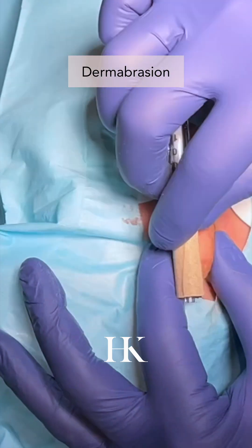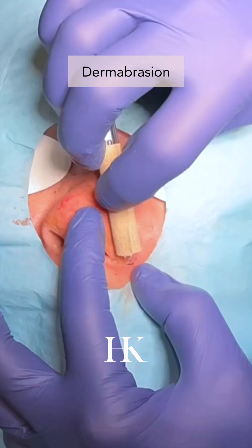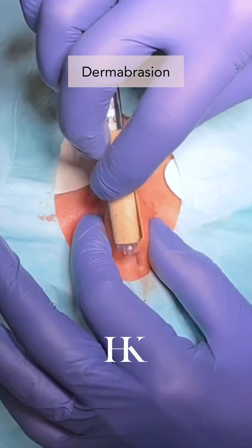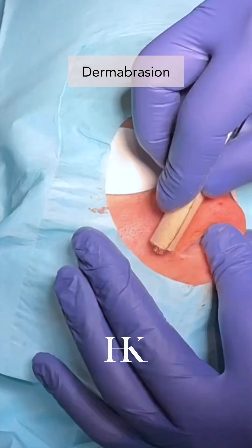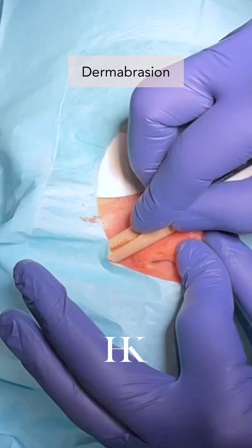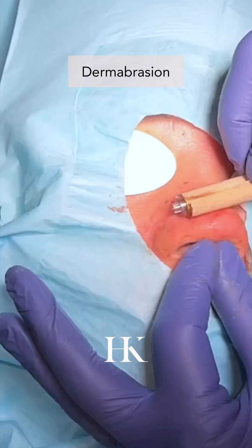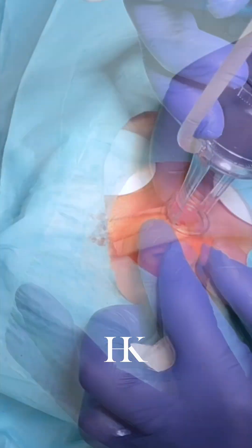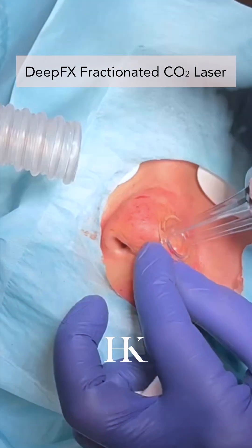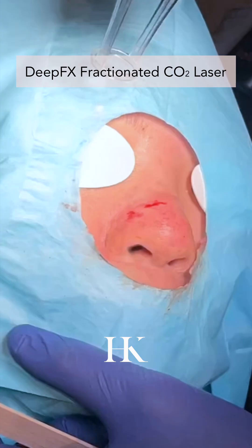Then we're using dermabrasion. This is just polishing the nose to make sure the contour is nice and regular, and it removes the layer that we just ablated.